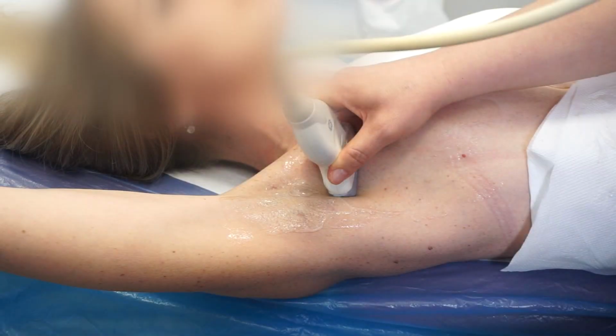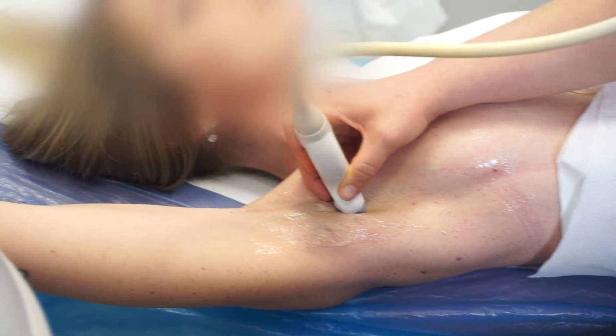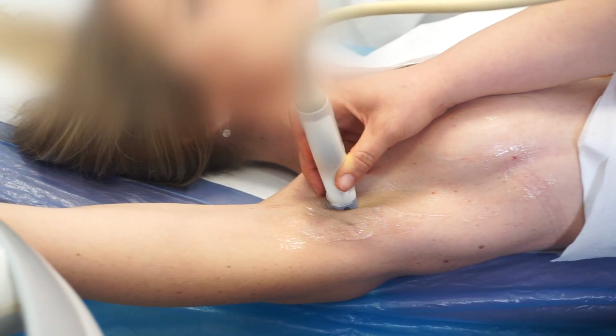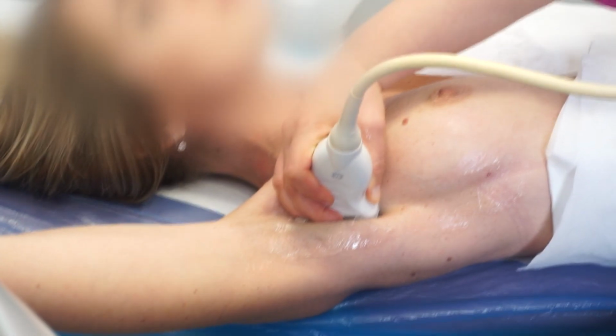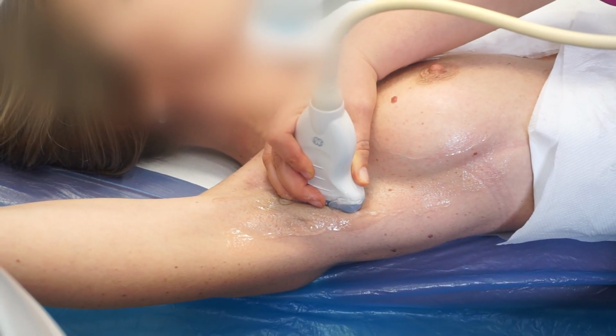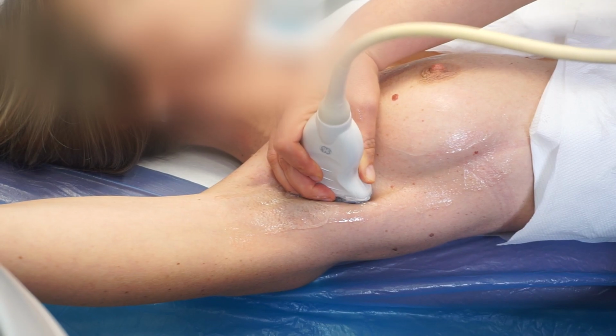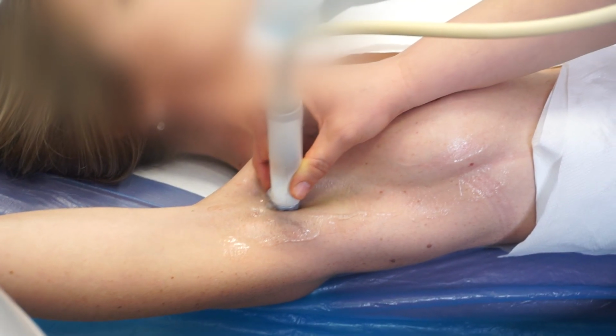We can now access and scan the first level of lymph nodes. The proper probe placement and movements are shown. First, the anterior group is visualized. Then, rotating the probe parallel to the anterior fold of the axilla, the posterior group is examined. Finally, the lateral group is examined.